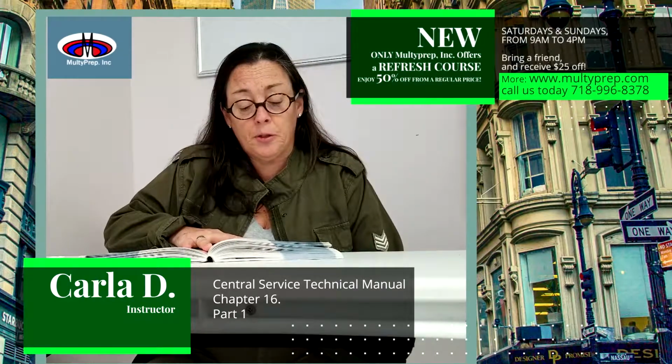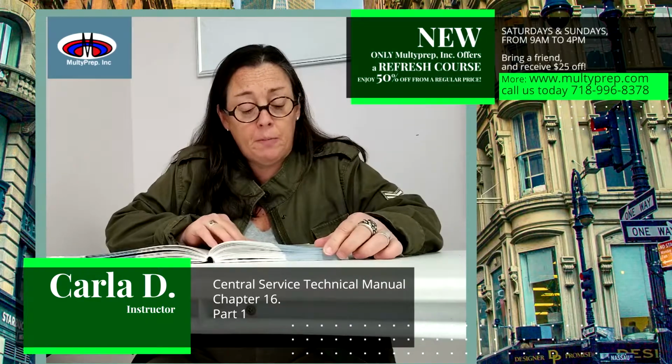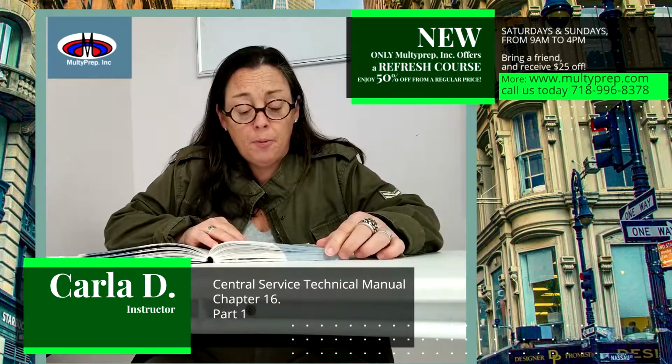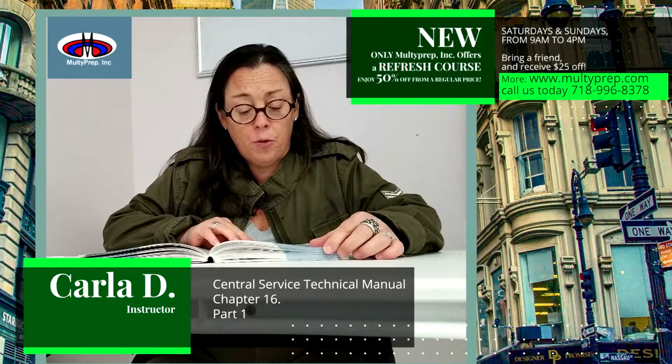Very dry air can affect seals and cause plastic materials to become brittle. Excessive humidity can cause tapes and labels to lose their adhesion, loosen seals, or affect package content identification. Moisture can also condense on the packaging material and seep or wick through it while carrying microorganisms to compromise pack sterility, leading to wet packs. Moisture also provides an excellent opportunity for fungal growth through the packages.